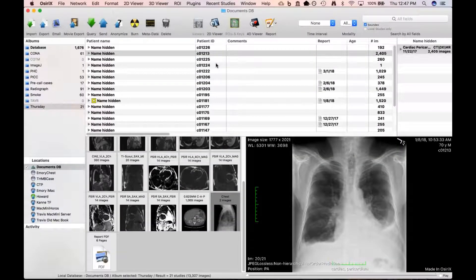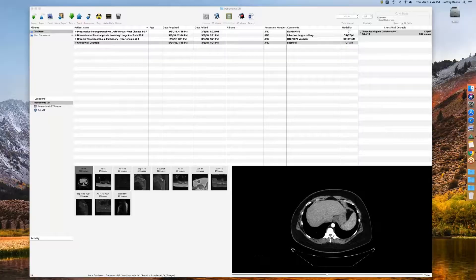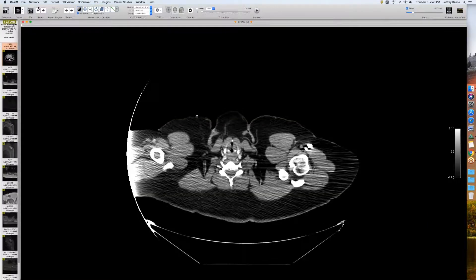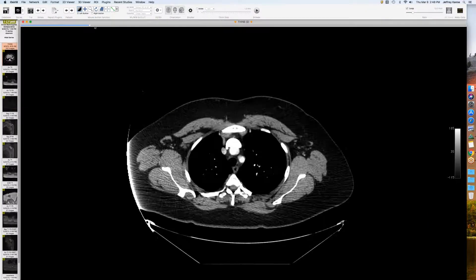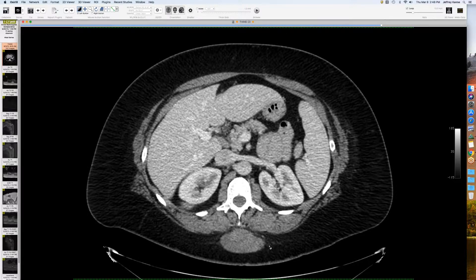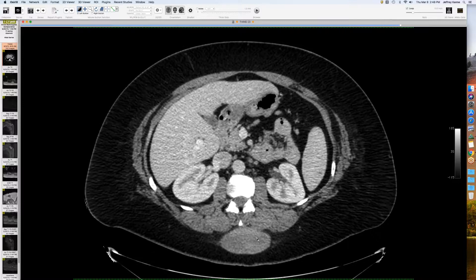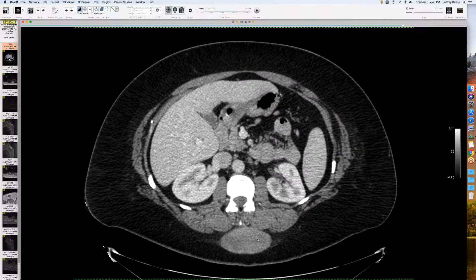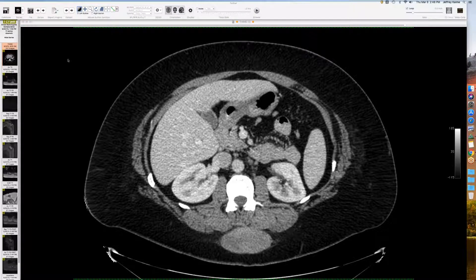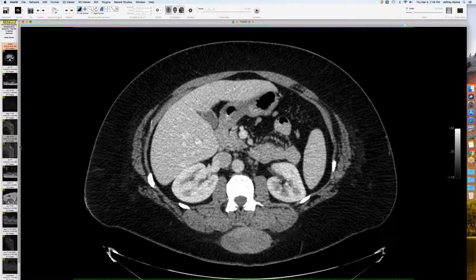I got a few here, not as exciting. Oh, this is a nice companion case — I believe Howard showed a desmoid a few weeks ago. Just another example of one here. You can see there's this soft tissue mass, well-circumscribed — which is a little unusual as they're often more infiltrative — in the posterior soft tissues, the fat just above the paraspinal muscles. And then there's another one here. Sporadic, as far as I know — I just found it this morning.